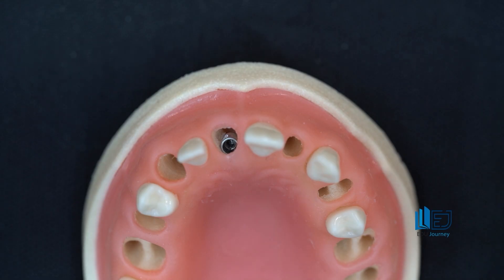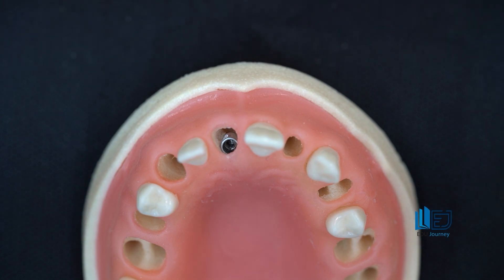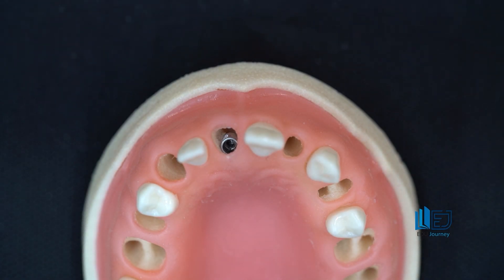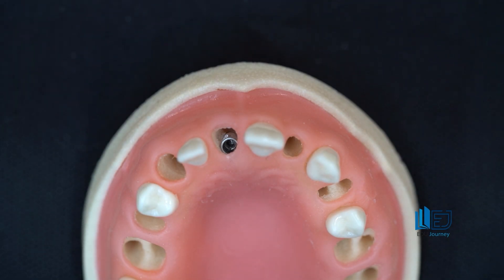If the socket is intact with all walls healthy, a simple allograft can provide a suitable gap graft at minimal cost and with high predictability. We place bone material not only precisely between the fixture and the bony wall, but also as a supportive element behind the free gingival margin — add extra bone material on top so it serves as support for the free gingival margin, so the free margin doesn't collapse and maintains its projection in the aesthetic zone.